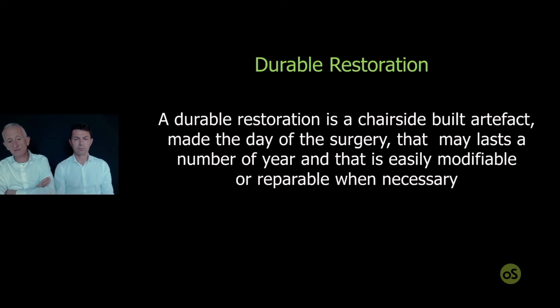With a durable restoration, we are aiming to make a bridge that we can sell to the patient as a final restoration. Okay, so this is a strong objective. We will discuss this pretty much in detail in a lecture that is dedicated just to this point, an entire lesson, but not now.